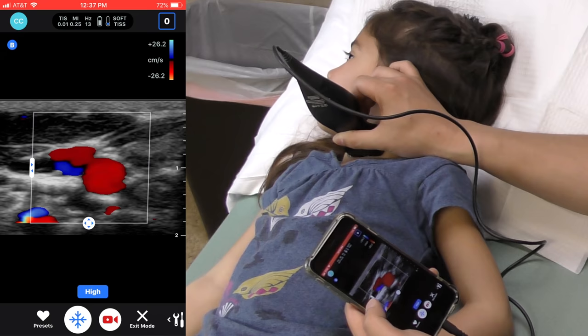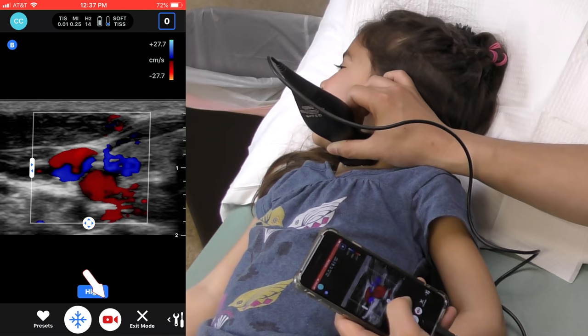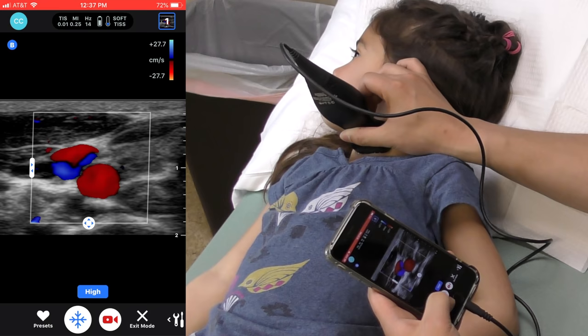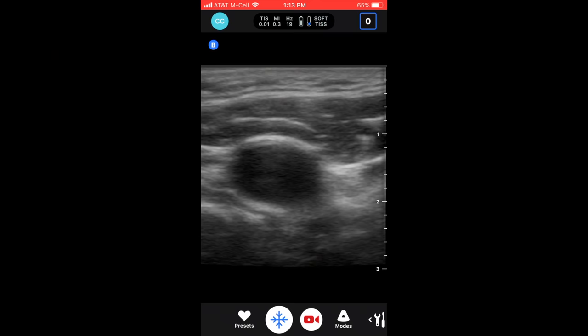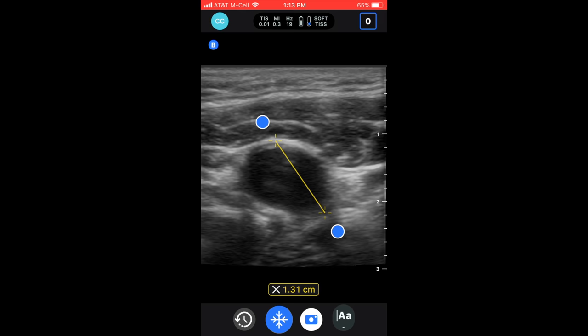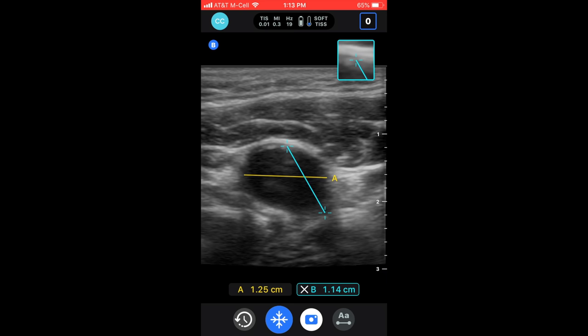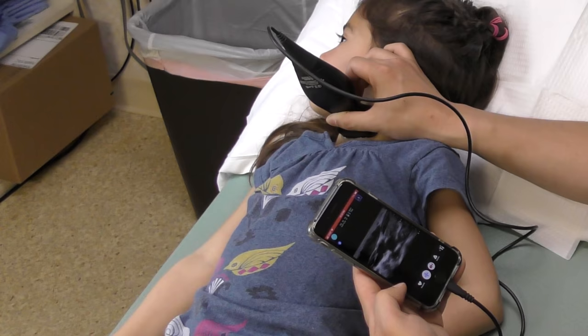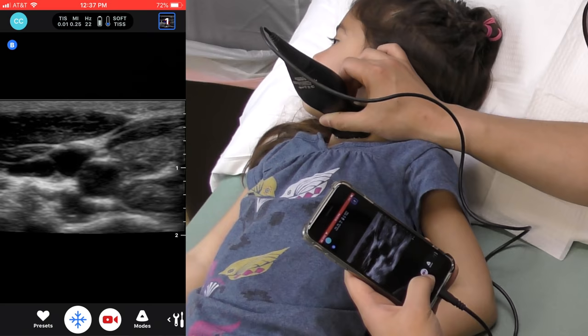Video can be recorded and saved by tapping the video icon at the bottom. Once the anatomic feature of interest is identified, a still image can be frozen and measured right from the smartphone app. The surface area can also be obtained and recorded.